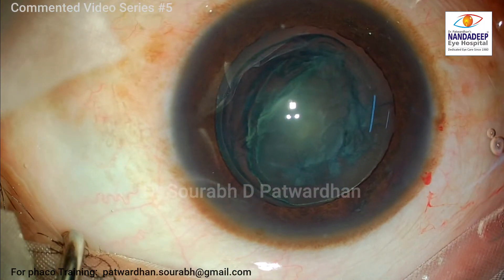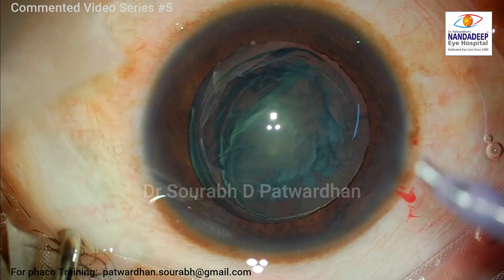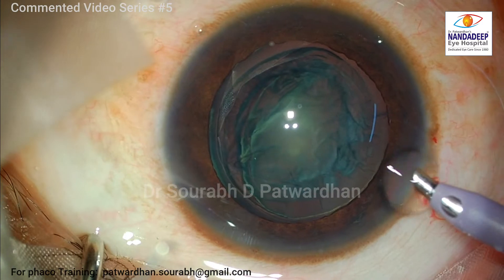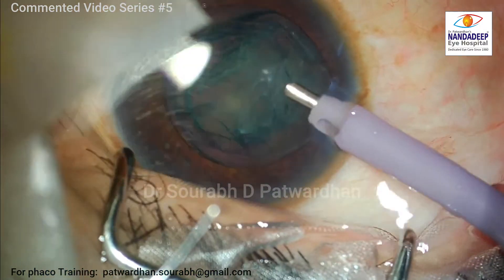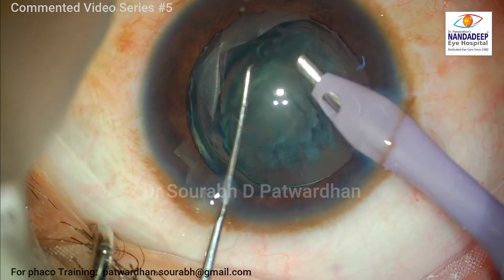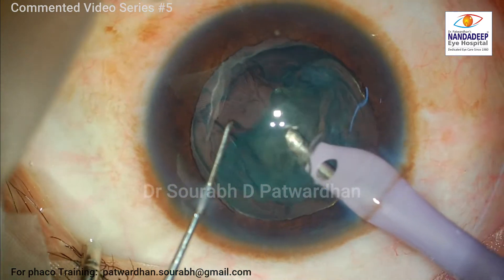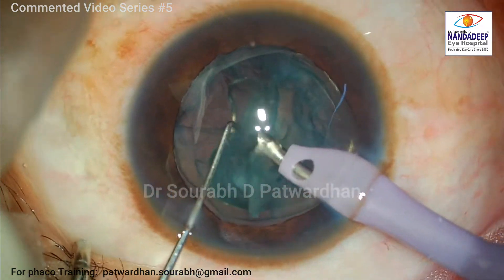The plan is to do phacoaspiration. There will not be any need for high phaco energy because this is a softer nucleus, as you can see. Luckily this patient doesn't have any deepening of the anterior chamber when the fluid is on, and the patient is quite comfortable and not feeling any discomfort. I have already reassured the patient in between.